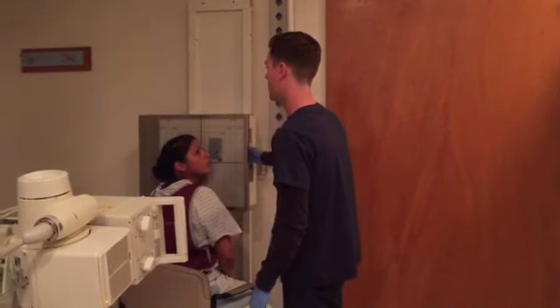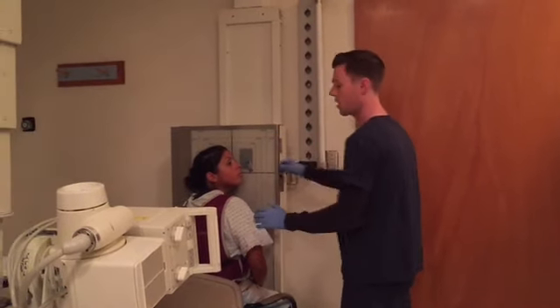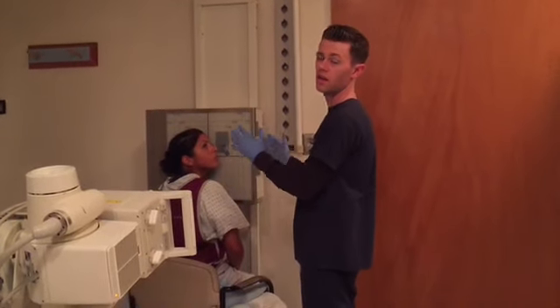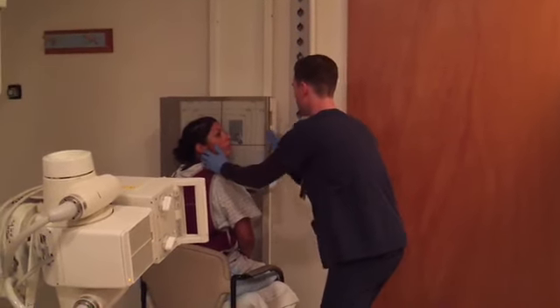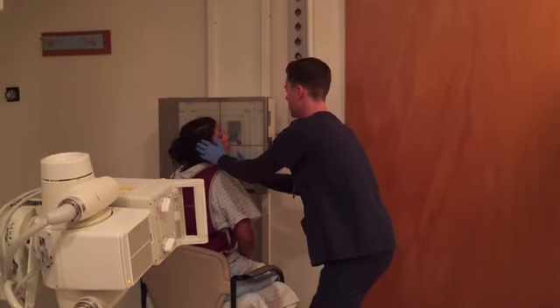Now, that was for the ramus of the mandible. Now we're going to do the body. So everything stays the same, angle of the tube and everything. We're just going to rotate the patient's head in 30 degrees. So go ahead and turn your head towards the Bucky, a little bit more, right about there.